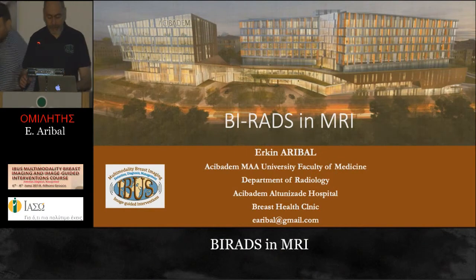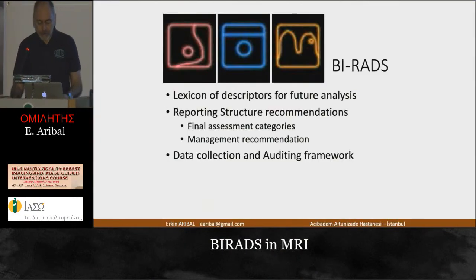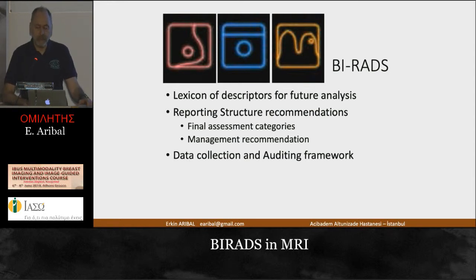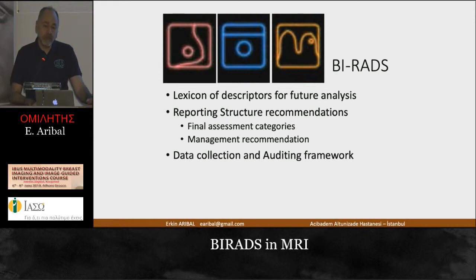Okay, BI-RADS MRI. I'll start with the same words: it's a lexicon for the common terminology between all radiologists. And there is a reporting structure, recommendations, and data collection for an auditing framework, which is also needed.